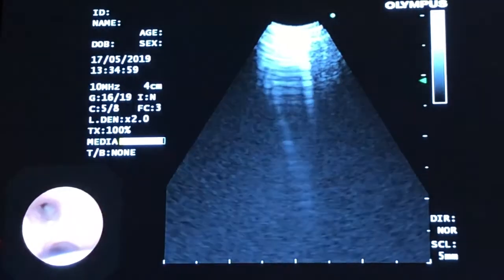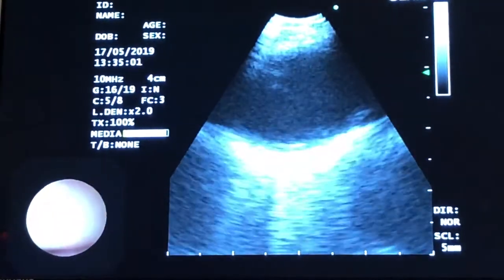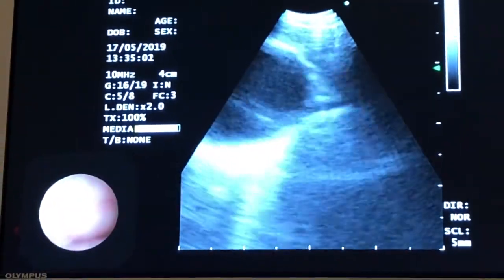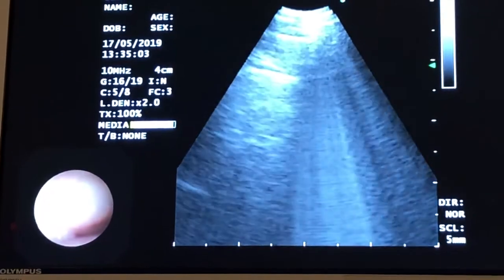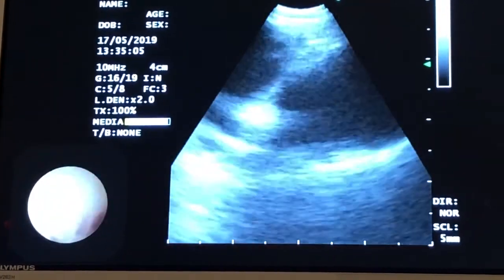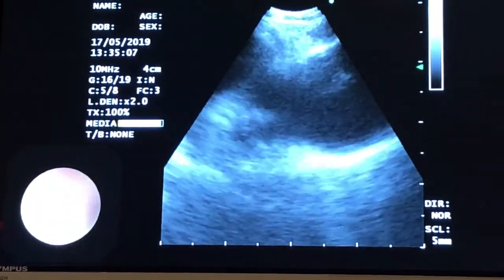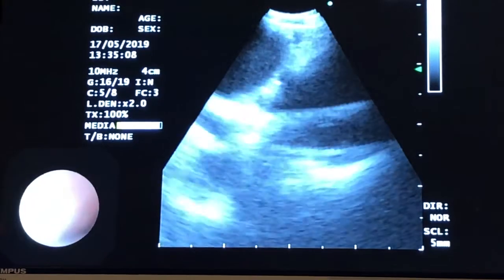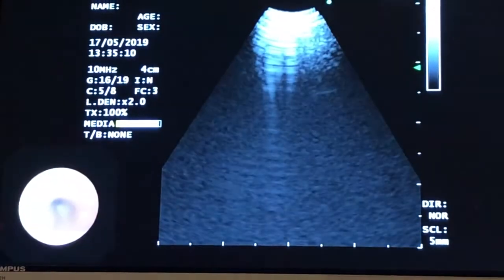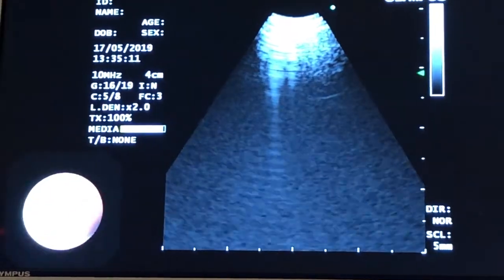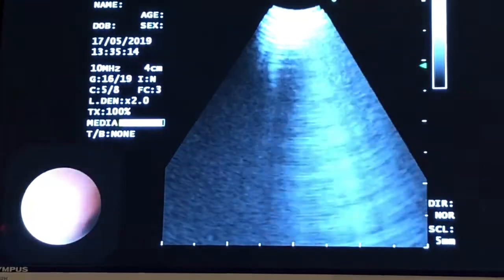Now we're performing the EBUS. We're back in the trachea and we're just going to do mediastinal staging. This is looking at the 4L, or the left paratracheal lymph node station. That was the aorta and on the left is the pulmonary artery. There was no lymph node in the 4L, which is a good sign.